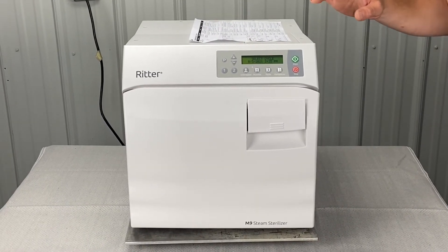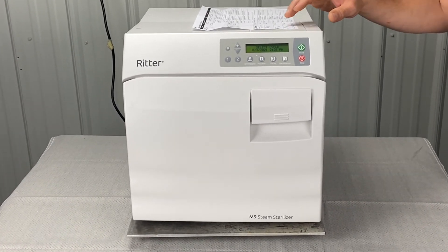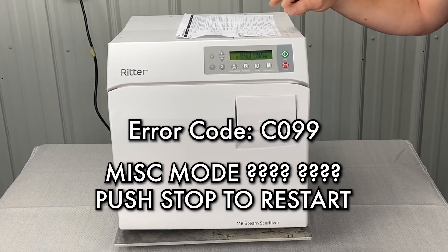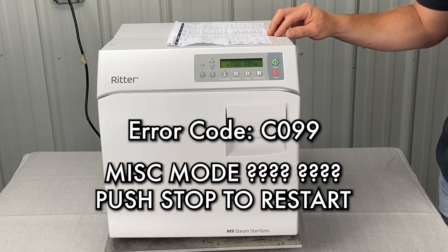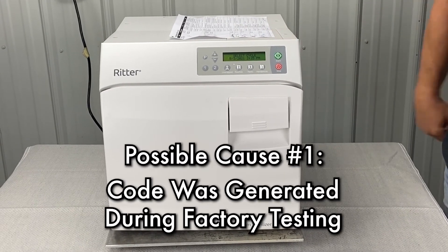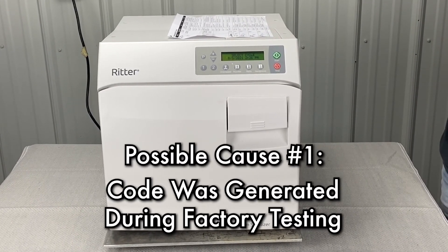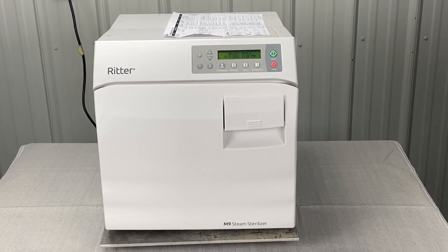Right now we're going to talk about the Midmark M9 new style error code Charlie099. Charlie099 is MISC mode — push the stop button to restart. This code was generated during factory testing, no check necessary. Press the stop button and initiate a new cycle.